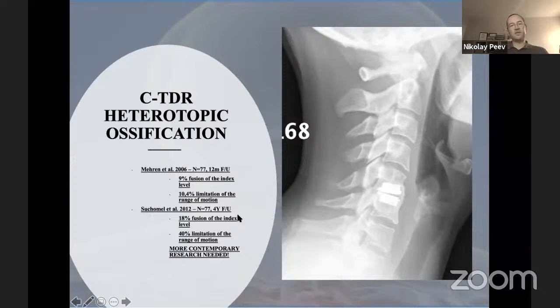In different publications, researchers link that to inappropriate posterior longitudinal ligament clearance, use of the cautery, or inappropriate preparation of the end plates. It happens, and it will happen, but with the new devices that percentage, I believe, is lower, and it also depends on your surgical technique, of course.